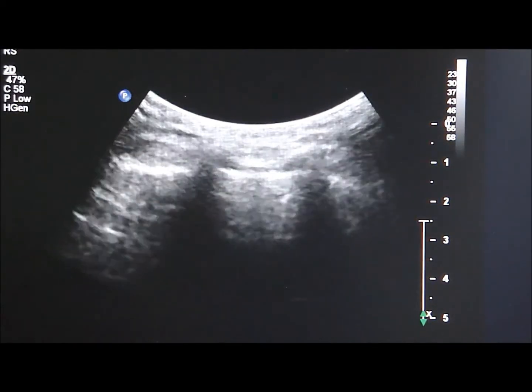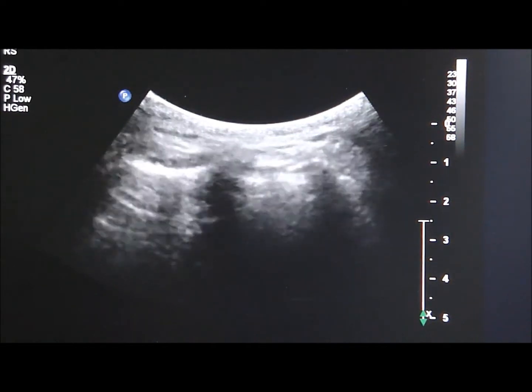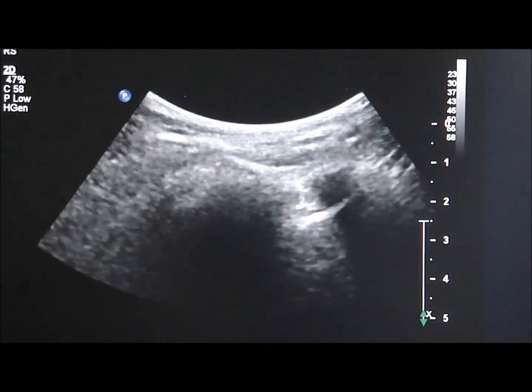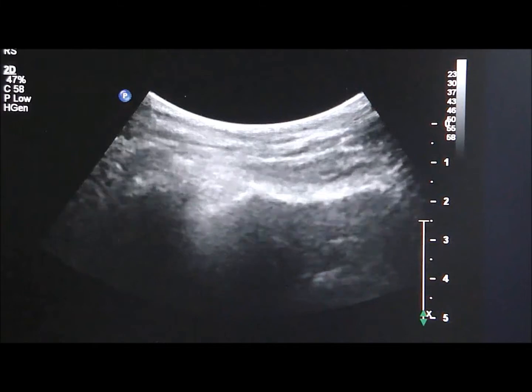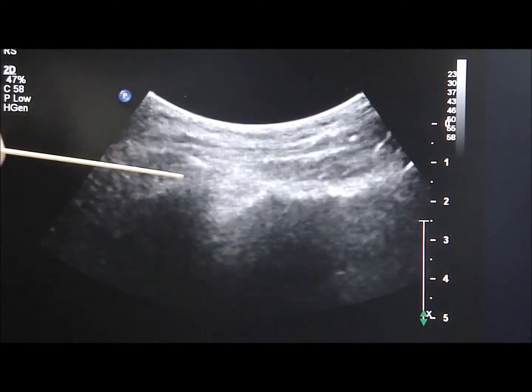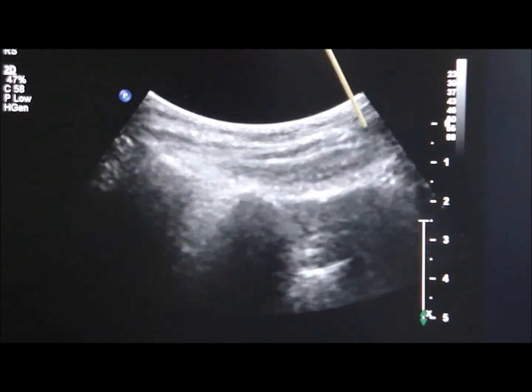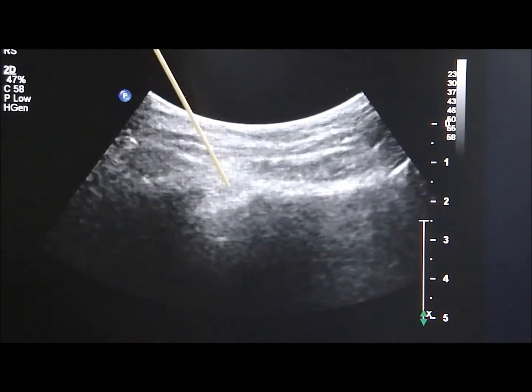The curvilinear transducer is used to identify the sacral hiatus first. Then the transducer is moved in a lateral direction until the lateral edge of the sacrum is observed. Then the transducer is moved in a cephalad direction until the sacroiliac joint is observed. This is the sacroiliac joint at the left side, and the injection needle will be approached in this direction to inject the injectant into the sacroiliac joint.